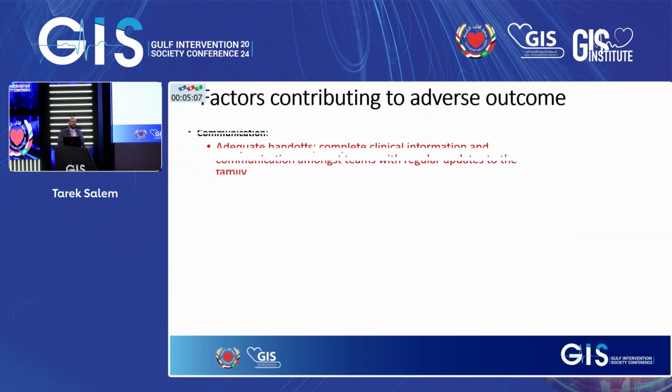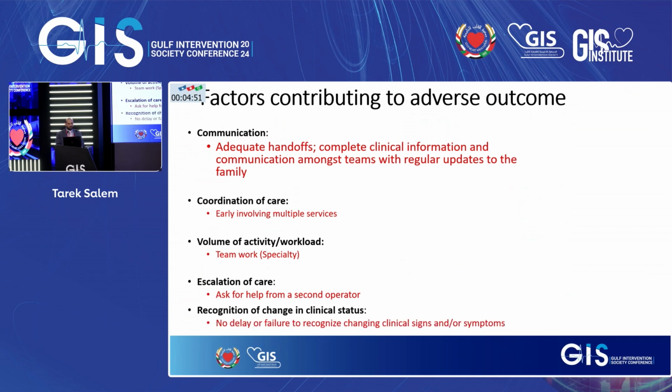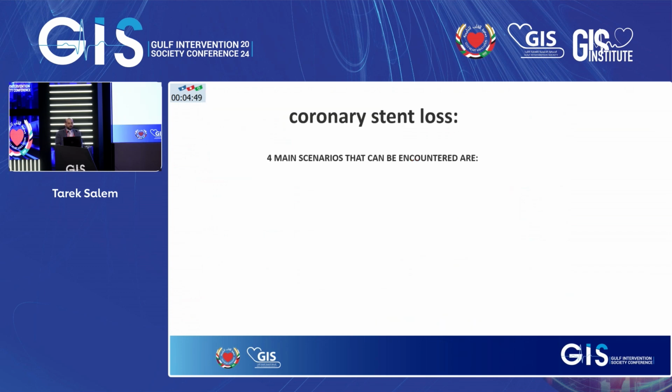I suppose: calm down, keep calm, call people, ask for help, ensure patient safety, and make sure that you talk to your team, acknowledge what you have, what we have done and what we're going to do next, okay? So I suppose this is a coronary stent loss.